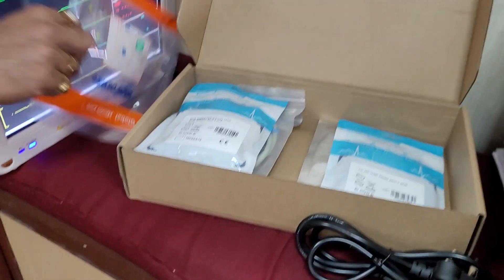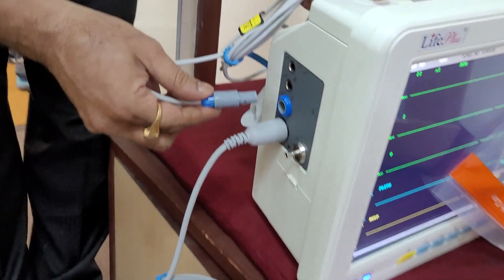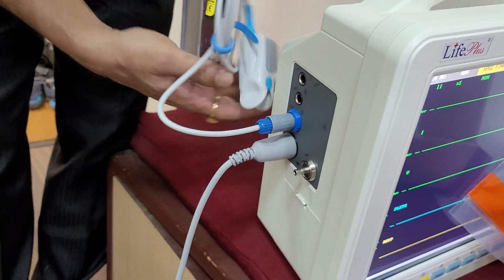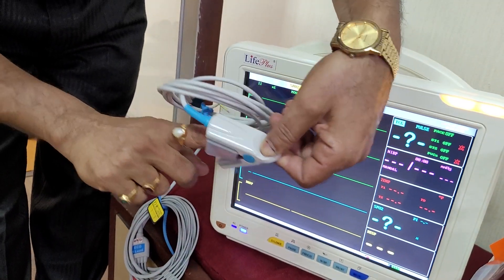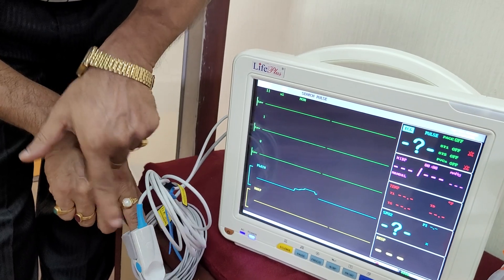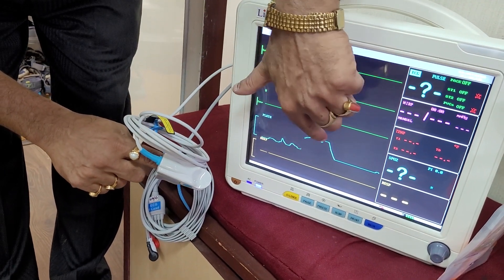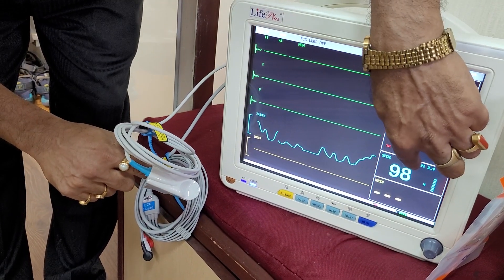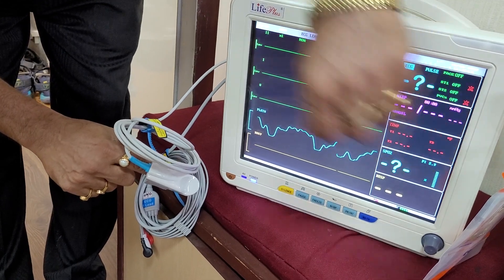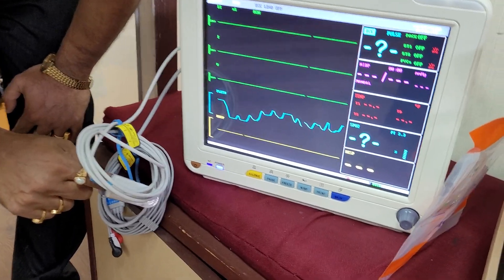Now another item I can show you. This is the SpO2 probe. How you can connect the SpO2 probe? Once you connect, the signal will be bobbling there. When I place it on my fingertip and show the plate, graphs will be shown and the number will stabilize within 5 seconds. 98 is the SpO2 reading.